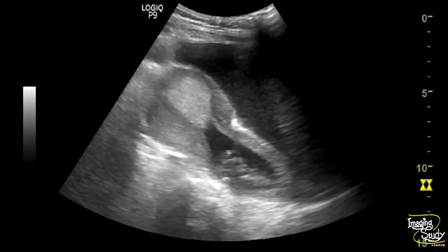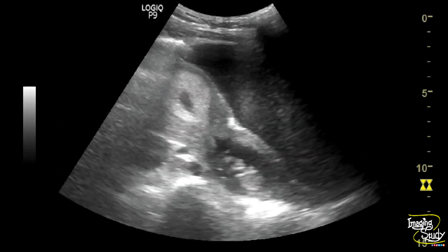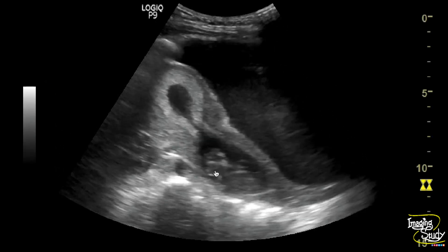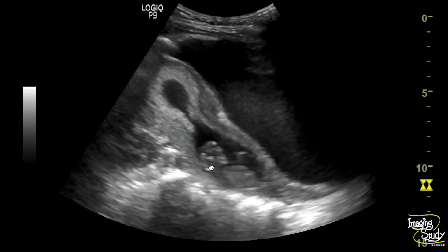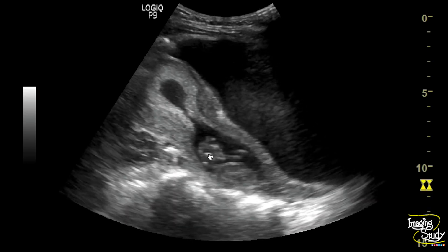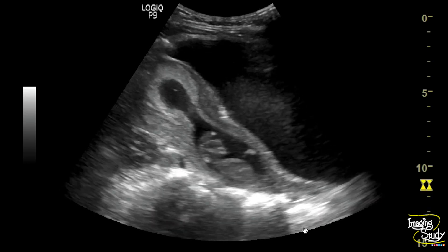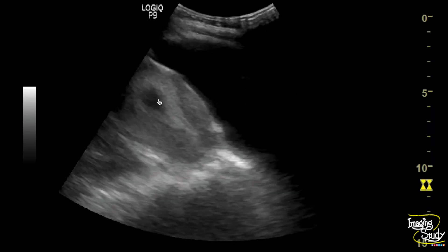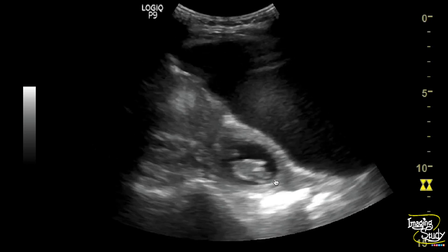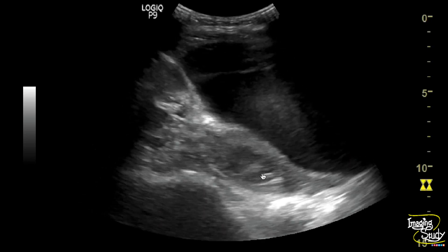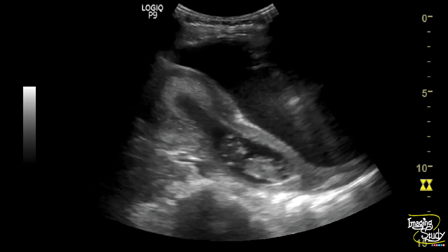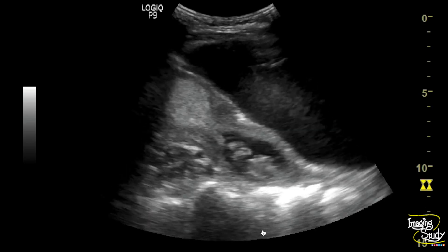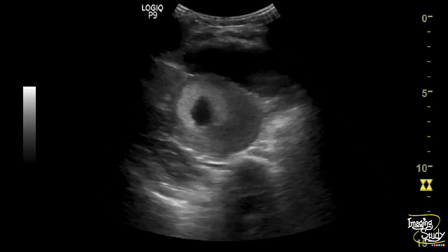Here you can see the longitudinal section of the uterus. You can see a live embryo moving within the cervical cavity. The gestational sac appears elongated and it extends up to the cervical cavity with the dilatation of the internal os.